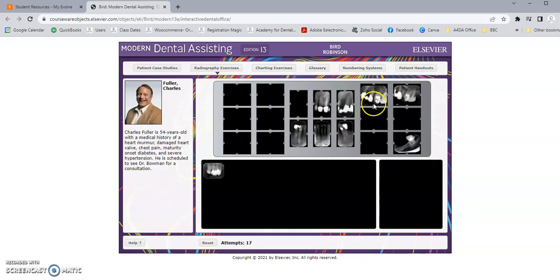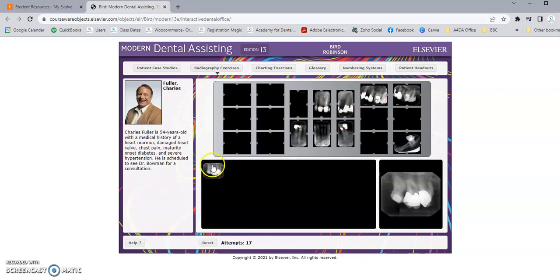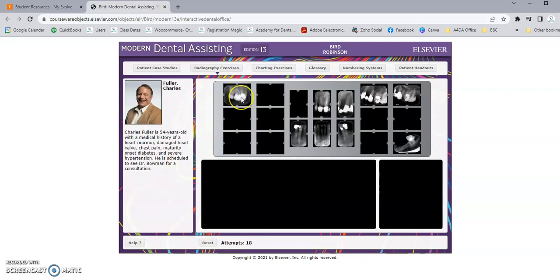So this is my molar shot, my premolar shot, my canine, my centrals, another canine, premolars, and molars. This is a good x-ray to show you — there are three roots on those molars, and three roots are on the maxillary. My molar shot, because it shows me the distal of the last molar, goes here. There aren't all the x-rays because this patient is missing all those other teeth. That is how you do mounting on Evolve.com Interactive Dental Office — you slide the x-rays into the correct spots.